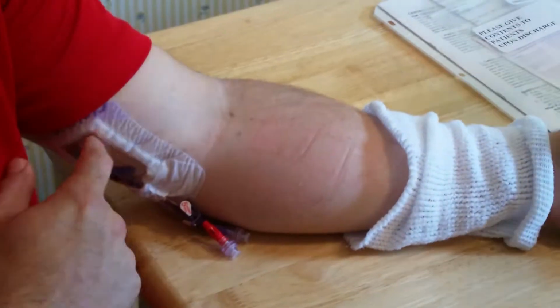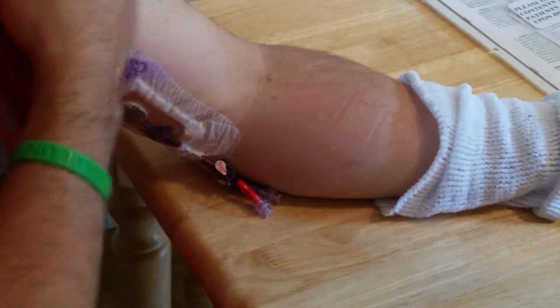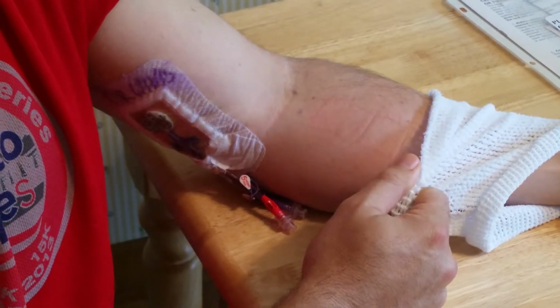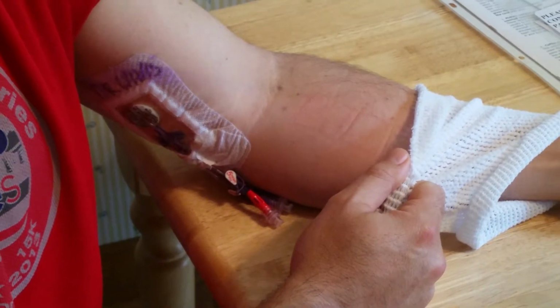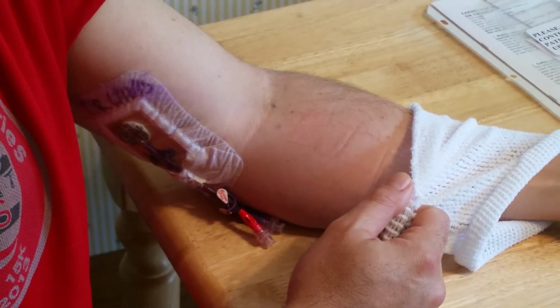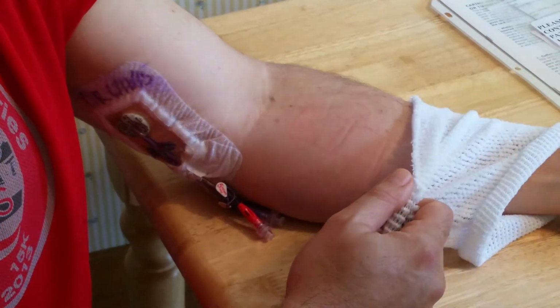Now, do you want to try to replace this or no? I'm not going to change that dressing today. I'll have them change that on Monday when they come. Since it was just changed, you don't want to expose it. Anytime you change it, you leave it open to bacteria. But since it was just changed on the 11th, and it looks like it's dry, all sealed and secured in there, no bacteria is going to get in there. I think we don't want to over change it. So we're done then. We're done.